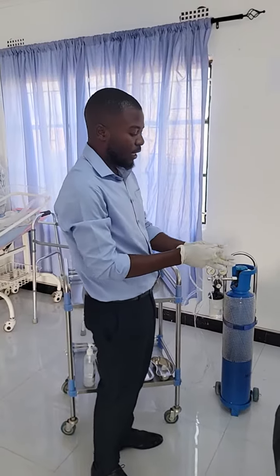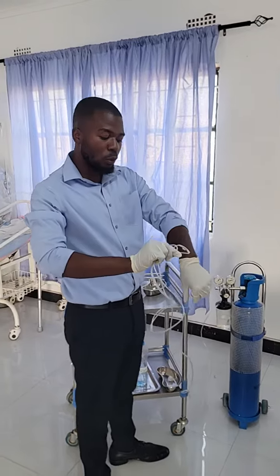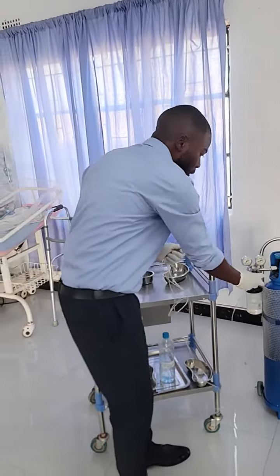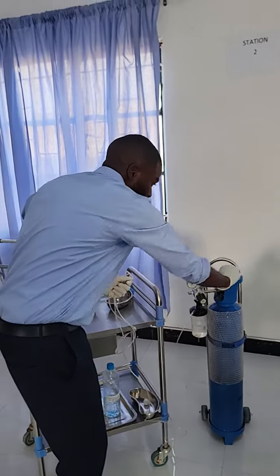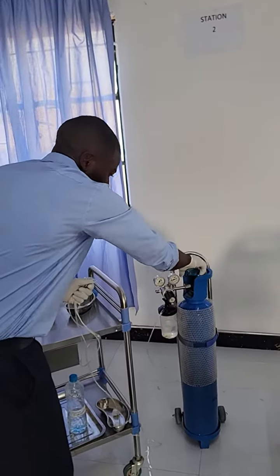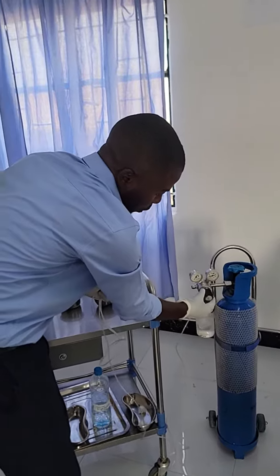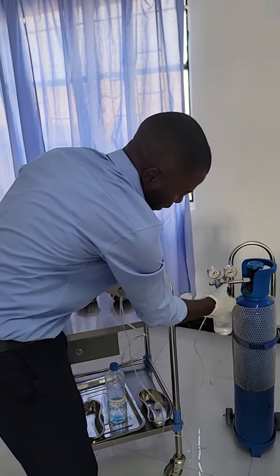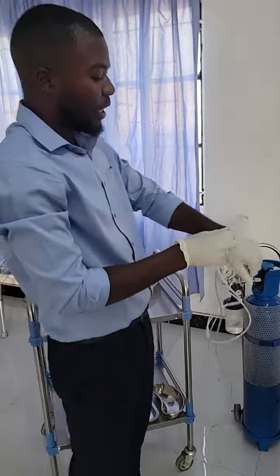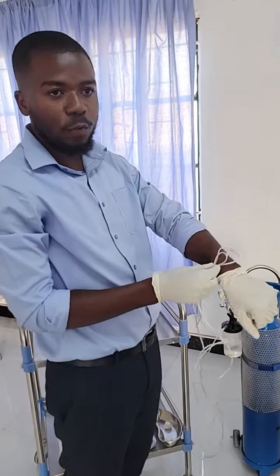Remember, before you do that, you have to make sure that this side is open. So you open here, and you also open there, like that. Then you test for pressure, or you test for air.